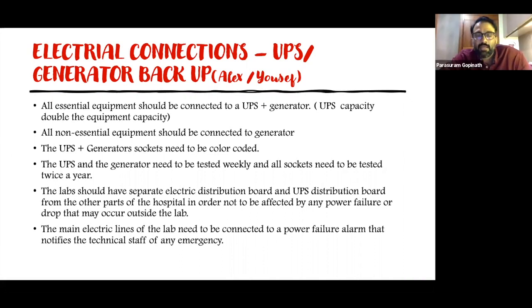Thank you, sir. Especially when you talk about situations like what we have in India, where we have longer power cuts, a lot of people ask whether we need a UPS when we have a generator. You should understand that the generator has to start, and when the current goes, there's always a few seconds for the generator to get on, even if there is an automatic switch on. Alex, do you want to add something here?